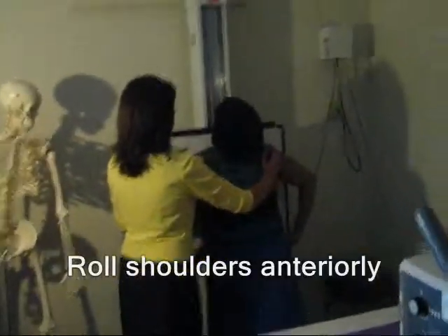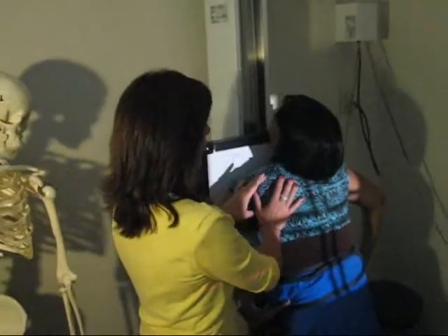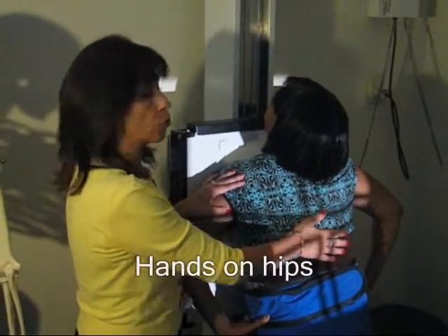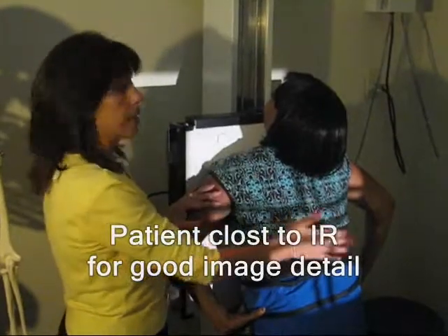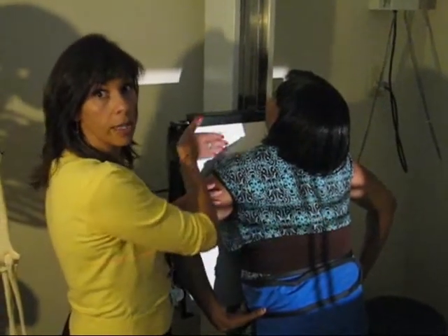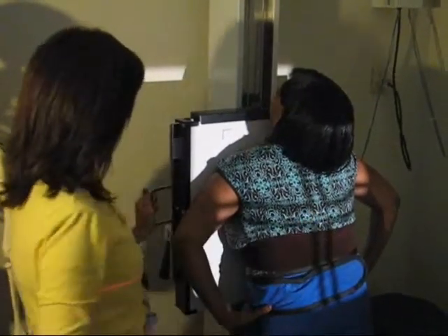Roll the shoulders in. The reason why you want them to roll the shoulders is because you want to get the scapulas out of the way of the lungs for better visualization of the lungs. Okay? You want them to go real close to the IR, because the shorter the distance between the body part and the IR, the better visualization and better detail you get. Okay?